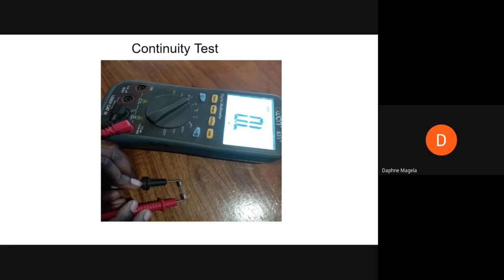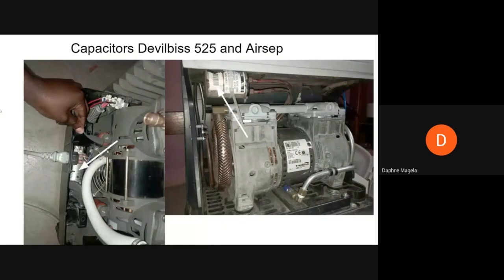A defective compressor capacitor can prevent the compressor from starting or cause it to stop running erratically. To replace the capacitor: turn off the concentrator, disconnect the power cord, remove the side and lower front panels, and locate the compressor capacitor. In the DeVilbiss 525 it is found just beneath the power cable connection; in the AirSep it is mounted on top of the compressor with a cable tie. Disconnect the two leads, slide the capacitor out, use a capacitance meter to verify it is defective, then install the new capacitor by reconnecting the leads and sliding it into place.